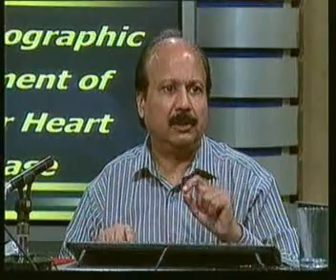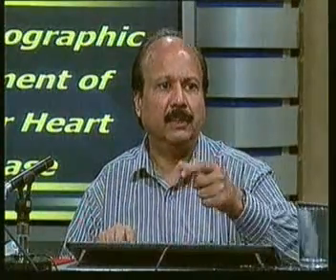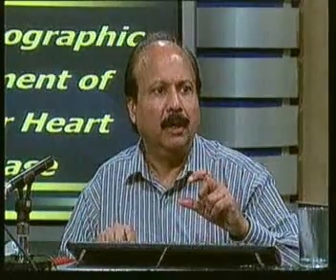Don't be in a rush to do the first valve area and say this is the valve area. No, as Dr. Manish is saying, it's extremely important to have a good image.